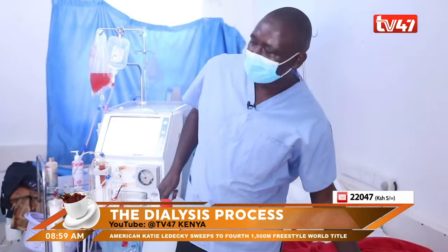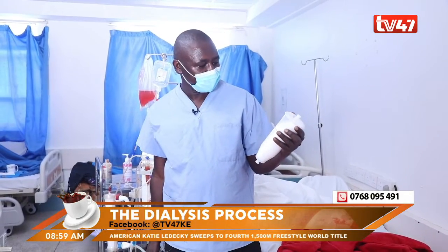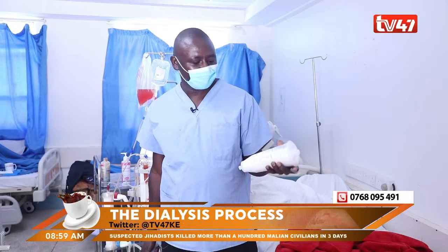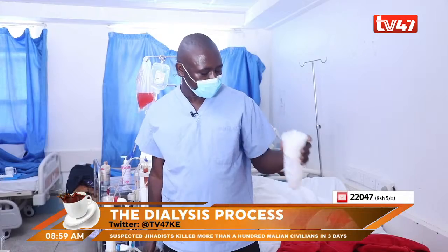And also this is called bicarbonate. This is the base. Sodium bicarbonate. Yes. But there are some electrolytes also, they are being incorporated inside.